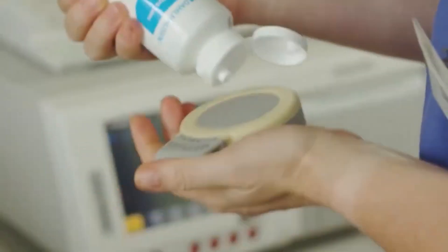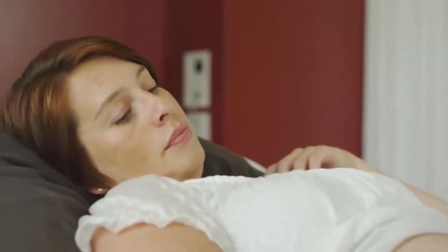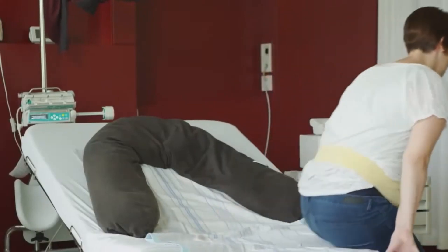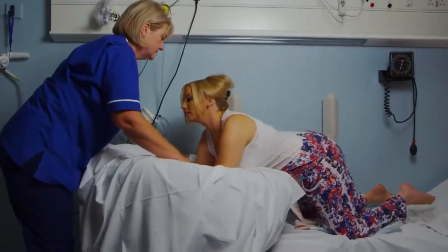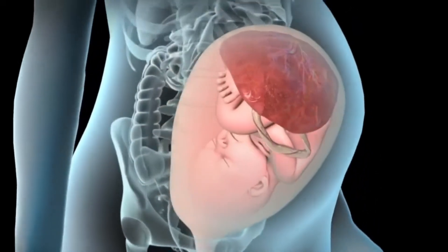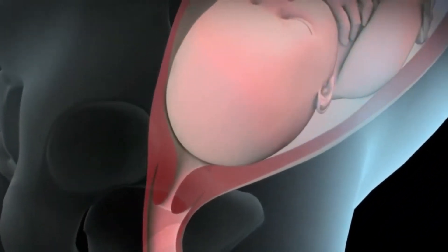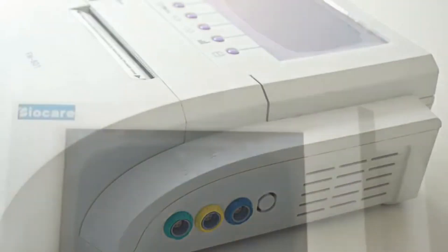Welcome to another video on Biomedical Engineers TV. In this video we will learn about Cardiotocography, which is also known as CTG, FHR monitor, or non-stress test monitor. We will keep it in a simplified way to explain about fetal monitors. In this video we look into introduction to fetal monitors and types of fetal monitors.